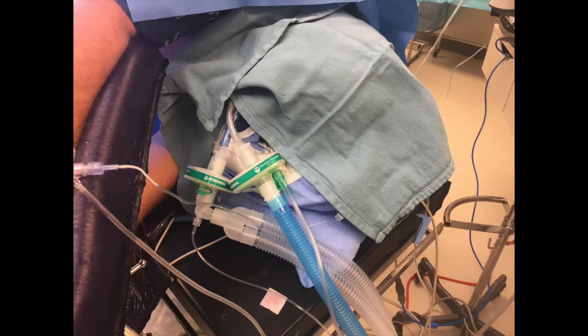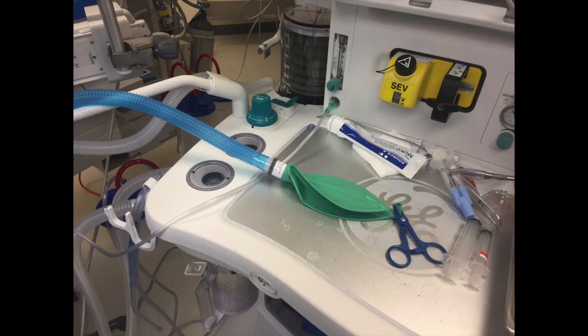Here we see our circuit, the patient end. The left lung is being ventilated and the right lung is the surgical lung, with the circuit connected. Here we place the bag on the table with the clamp on. Notice that we've removed one of the Y connectors in the heavy clamp. It's not necessary since we're going to start one lung ventilation from the very start of the surgery. It's just an extra weight distraction.